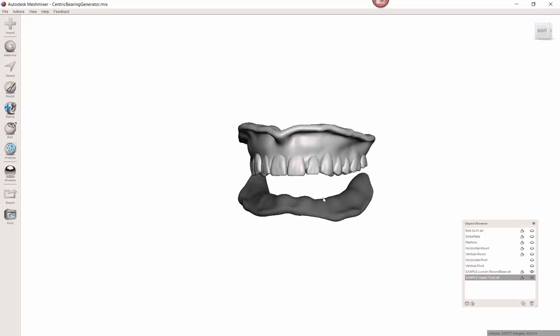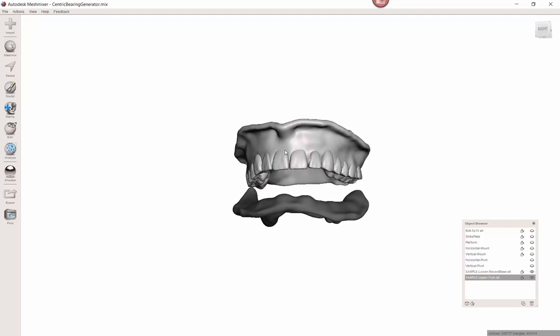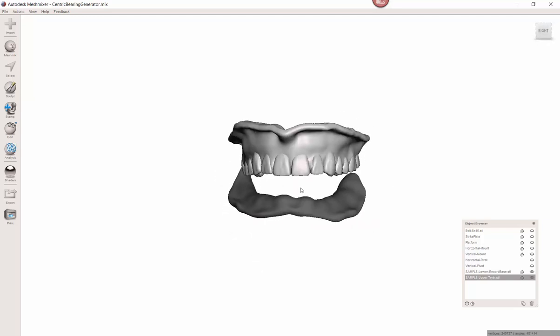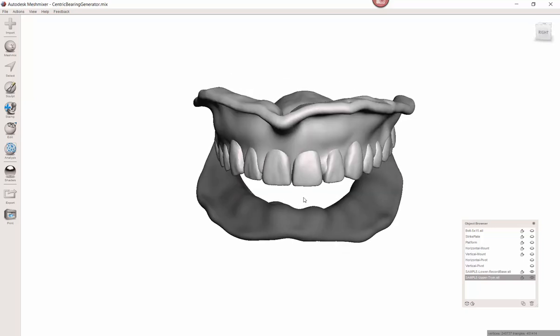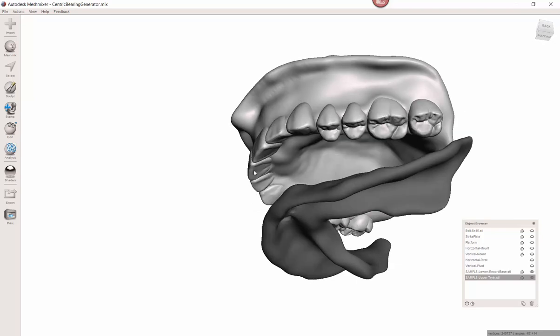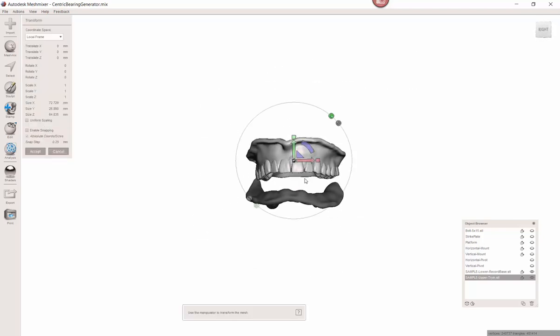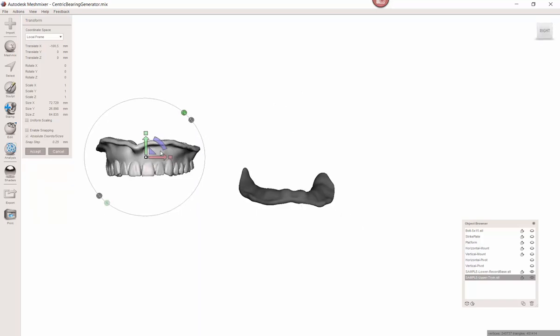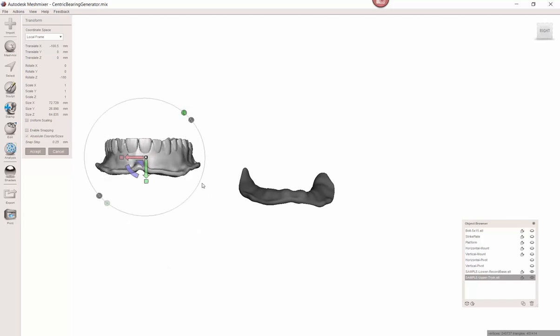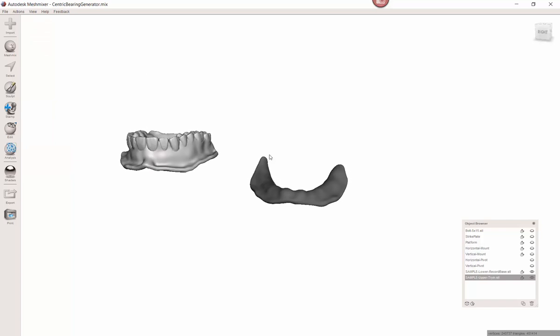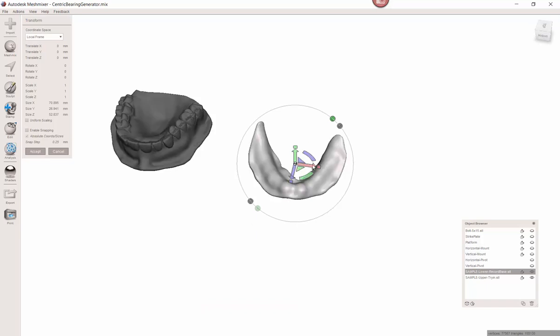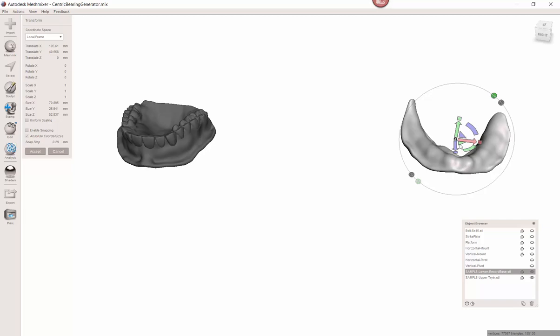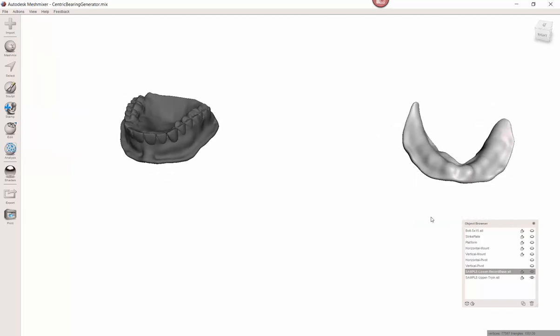This lower is our custom tray as well. We're gonna border mold and use this for our impression tray. But we don't have any lower teeth because he purely guessed on the upper teeth. And there's no way to guess the VDO, to guess how far the lower arch is away from it and where it lines up. So we're not gonna bother messing with that. Instead we're gonna use this centric bearing device to do a gothic tracing and determine our VDO. So anyway, let me do something right quick. I'm gonna go ahead and move these. I hit the T button which is transform. And I'm just going to get them completely out of whack.